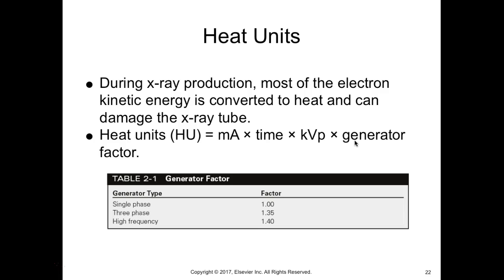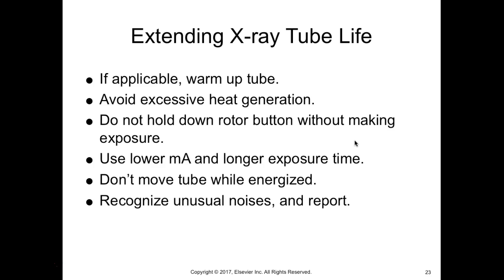And then there's graphs that you can check to make sure that you're not going to damage your tube when you're making exposures. So to extend the X-ray tube life, you'll want to warm up the tube. If it's been sitting and it's a cold tube and you get a patient and you're doing a lot of really high energy X-rays, you could actually crack your tube. You can crack your anode. There's all bad things that can happen. So you'll want to warm up your tube if it's been sitting for a long period of time.